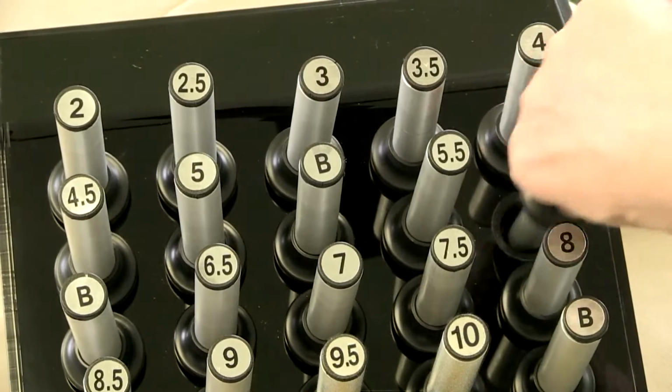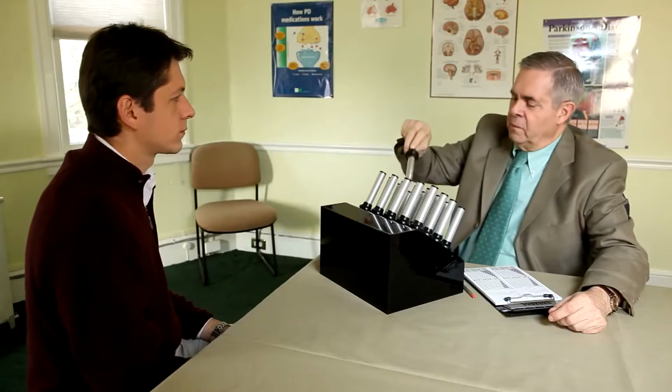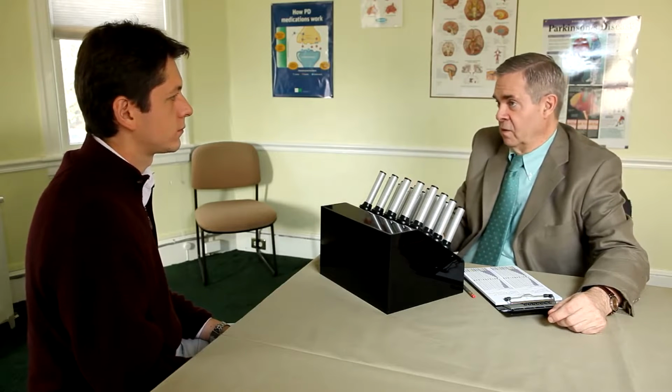Today we're going to be testing how well you can smell, your sensitivity to odors. And what I'm going to do is I'm going to be presenting two stimuli to you. For example, here's the first one, and here's the second one. What I'm going to be asking you to do is tell me which of the two that I present is stronger, the first or the second. If you're not sure, you have to guess. You have to tell me one or the other, okay?